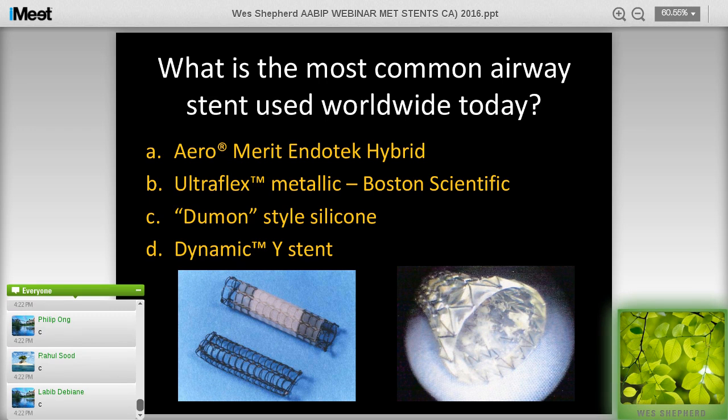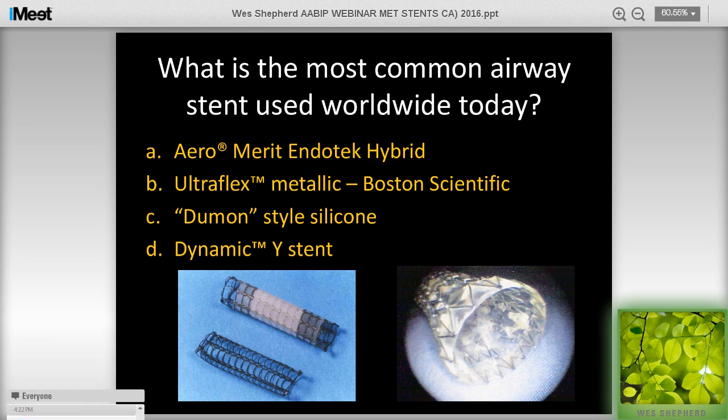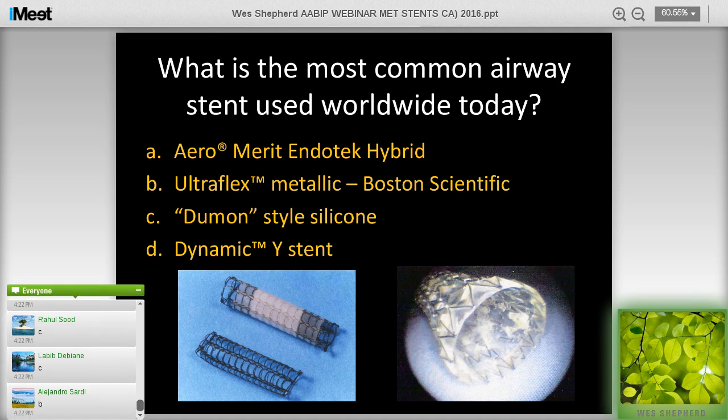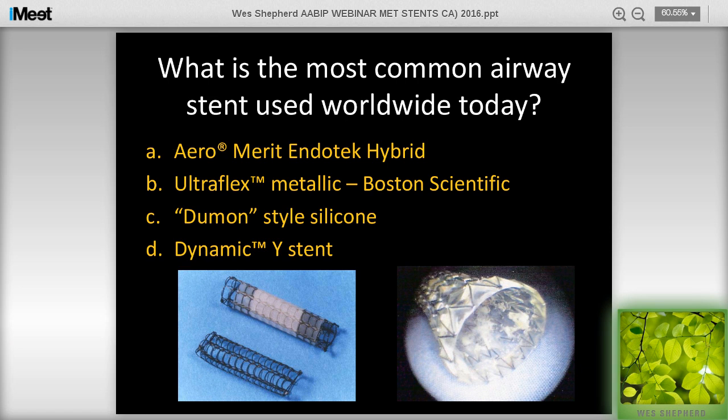Right. So a number of you, I'm getting a lot of C's, so you guys are a very international and global group. So the reality is it's very likely the Dumon style silicone stent, because of its popularity and widespread use in Europe and other countries.